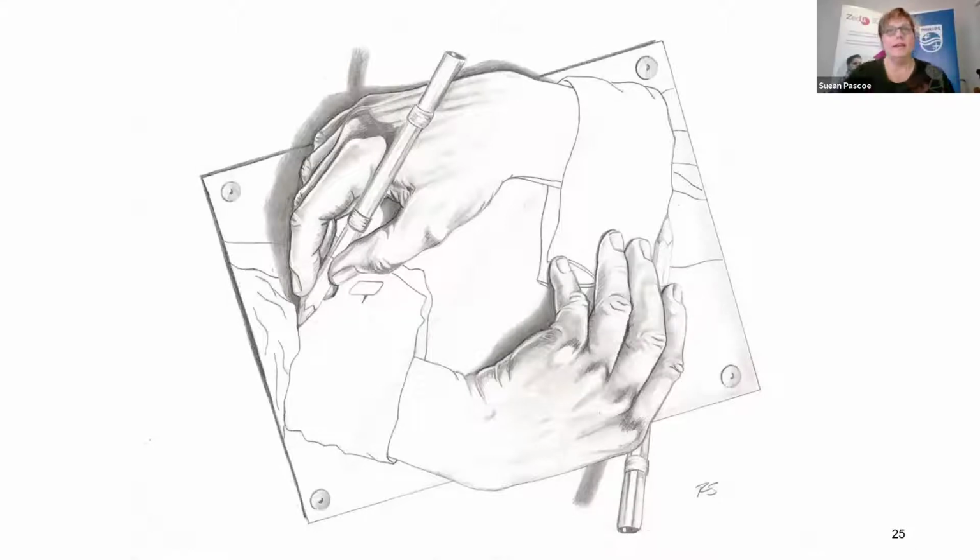So at the scout scan phase, use your preferred hand. By the time we get to inject, just hold the probe still and in place with your non-dominant hand so that you're injecting with your dominant hand.